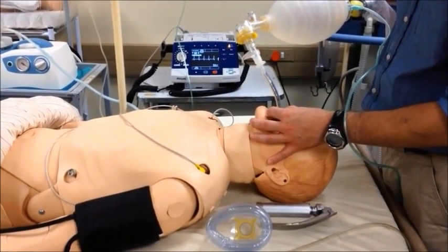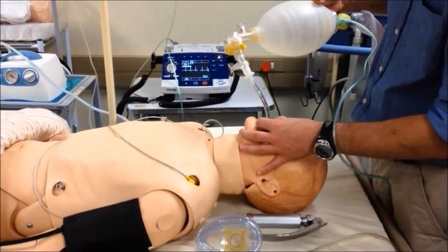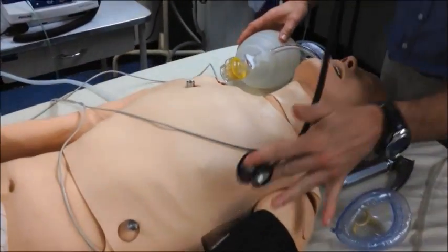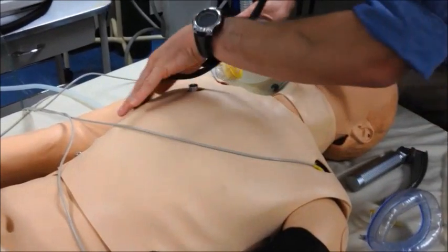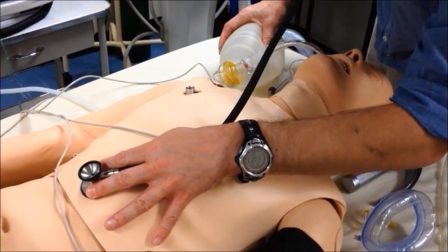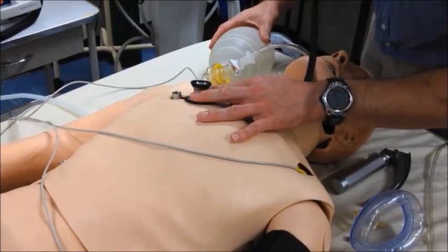For demonstration purposes I will now let go of the tube to demonstrate five-point auscultation. Please remember that in reality you would not do this and you would not relinquish control of the airway itself. Five-point auscultation with the stethoscope follows a sequence of the left axilla, the right axilla, listening for air entry, the epigastria — listening for the gurgling of air bubbles that will follow on esophageal intubation — and then a final confirmation of equal air entry.